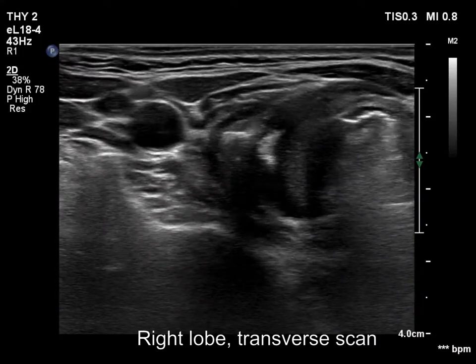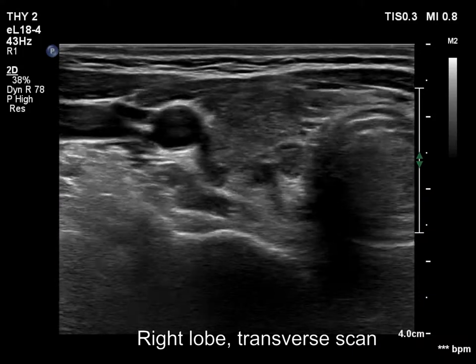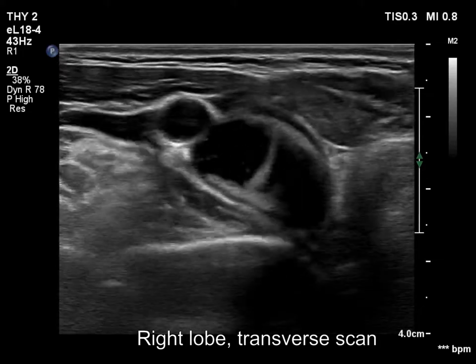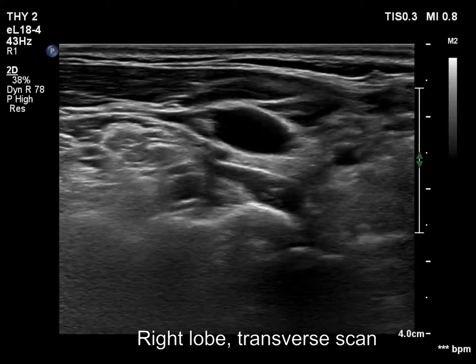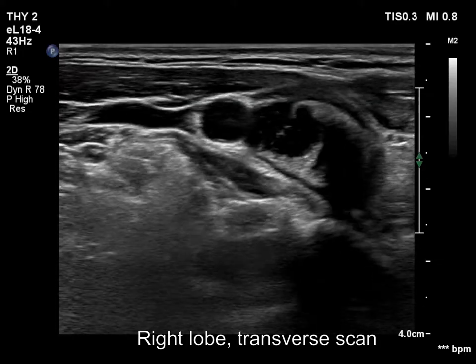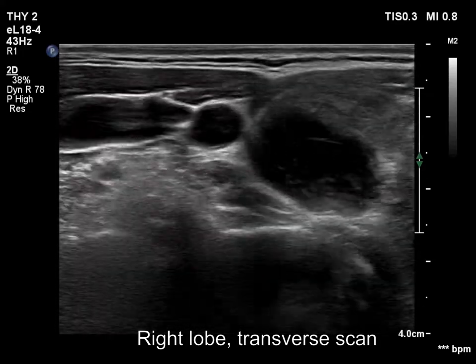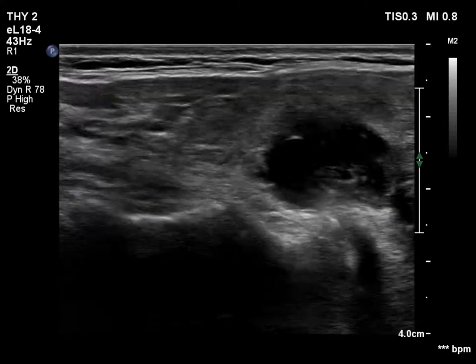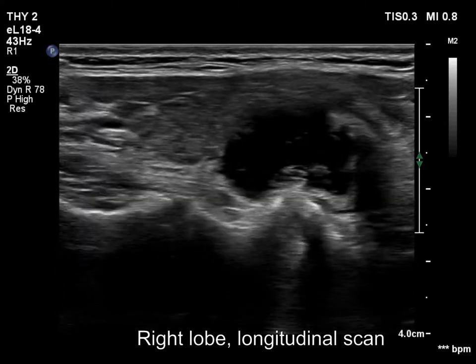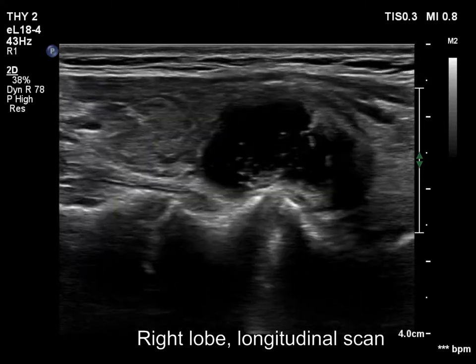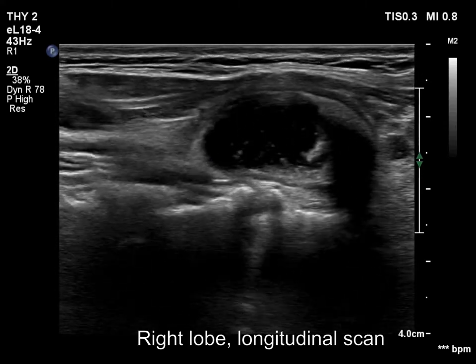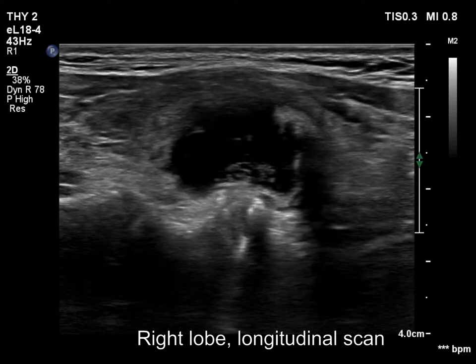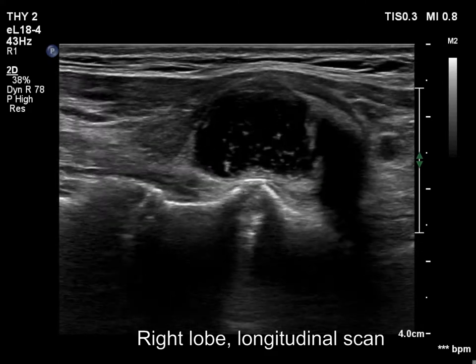The thyroid is decreased in size and has hypoechoic areas. There is a dominantly cystic mass lower and dorsal to the right lobe. The solid part is echonormal. The cystic part has echogenic figures, which is an unusual finding in a parathyroid cyst.